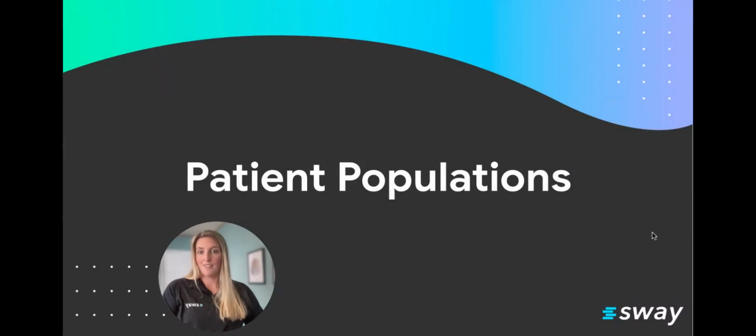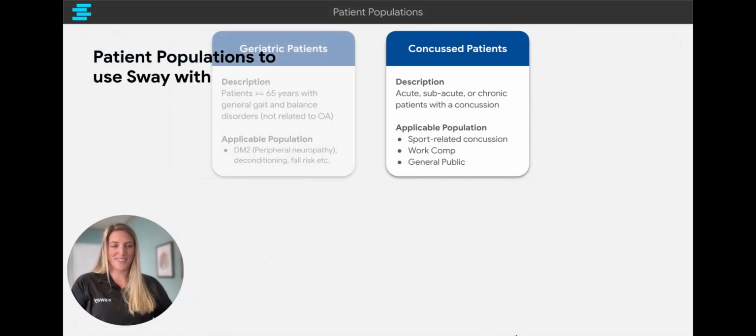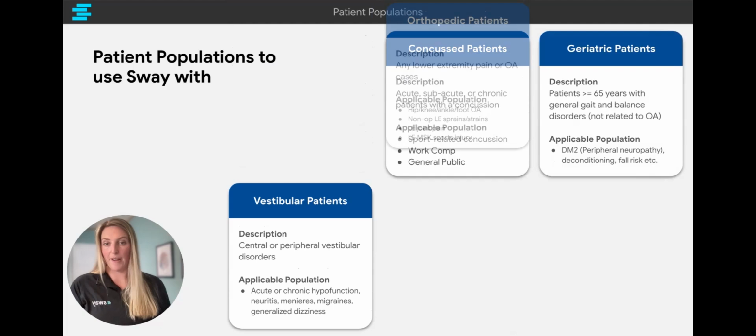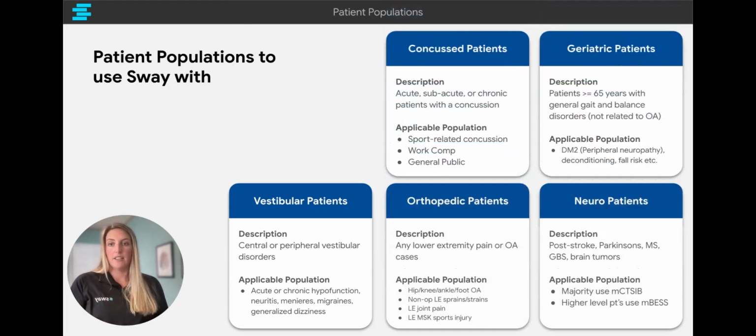So next up is just kind of an overview of patient populations. This slide is always near and dear to my heart. I used it in presentations that I gave to my upper management. And really just from the idea that this technology at its core is objective, balance, and cognitive assessments. So of course, it could be used on my concussion patients, and that's what I was pushing it for. That's how I learned about it.